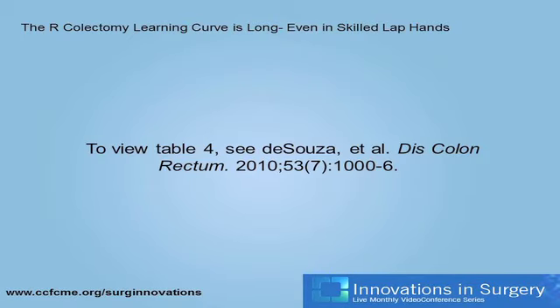So let's look now at some of the robotic data. This is a good paper from a very experienced laparoscopic team that looked at their laparoscopic procedures and then their subsequent robotics. And it's sort of the recurring theme of all of the robotic literature, really, that the OR times are significantly longer. The clinical outcomes are about the same.